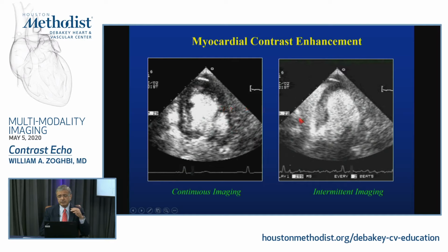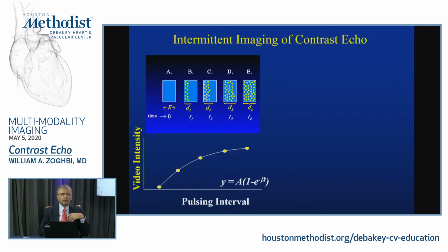Nice delineation. Here, if I do intermittent imaging, so I let the contrast come in, not be destroyed, look at how much enhancement I have in the myocardium compared to the cavity itself. And this is where some of all the research and all the work was done, quite a few from Dr. Sanjiv Kaul, Kevin Wei, Jonathan Lindner, Tom Porter, ourselves, we did quite a bit of that with Jorge Sharif, and myself, and our fellows. And I think this is the principle.